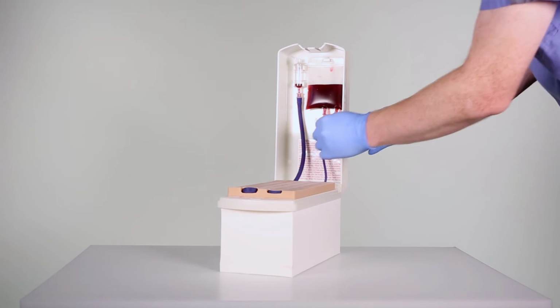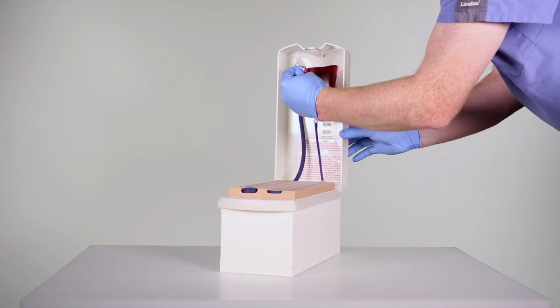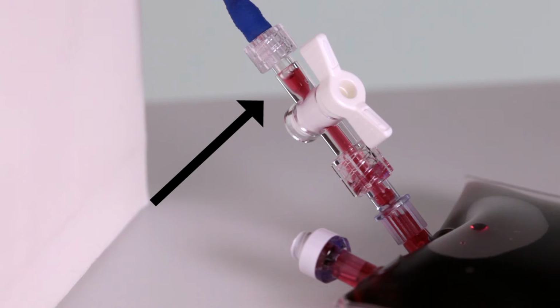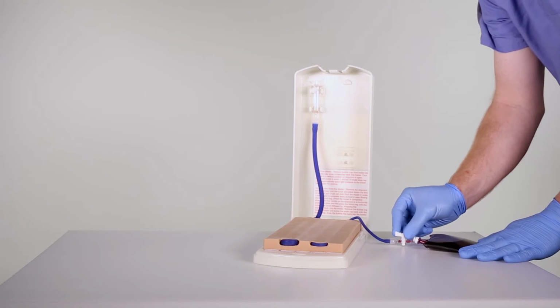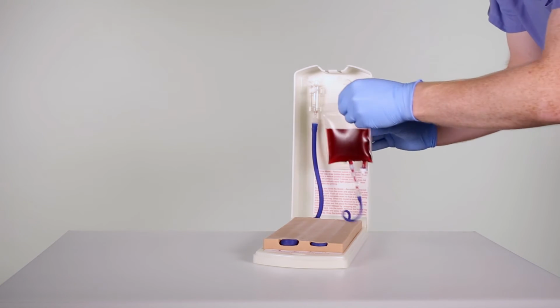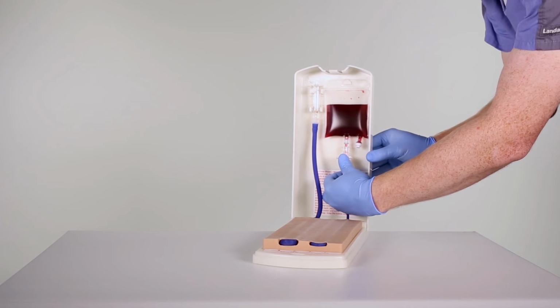To store the model, remove the stopcock and unhook the blood bag. Drop the blood bag below the level of the tissue pad to start draining. When blood stops flowing through the stopcock, the model is drained. Turn the stopcock 90 degrees to prevent blood from leaking. Return the bag onto the hook and press the stopcock into the holder. An audible click will confirm proper placement.